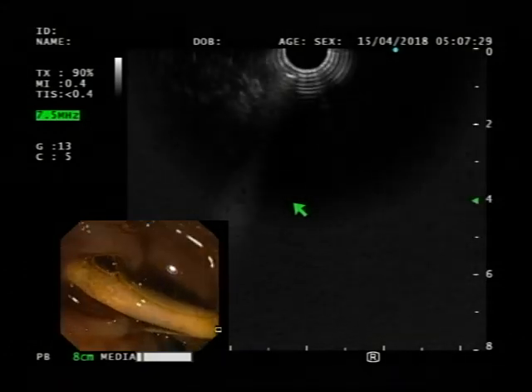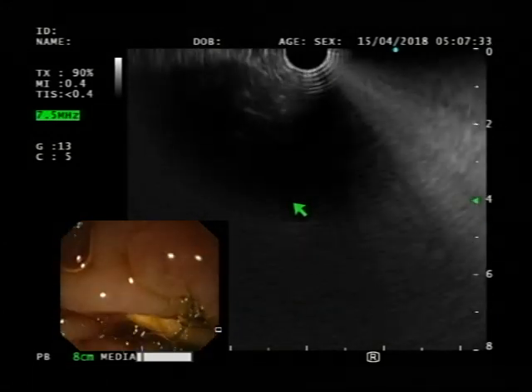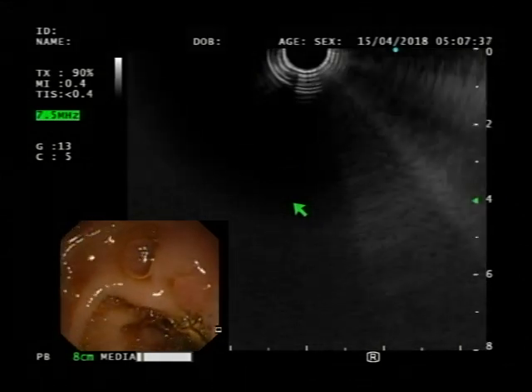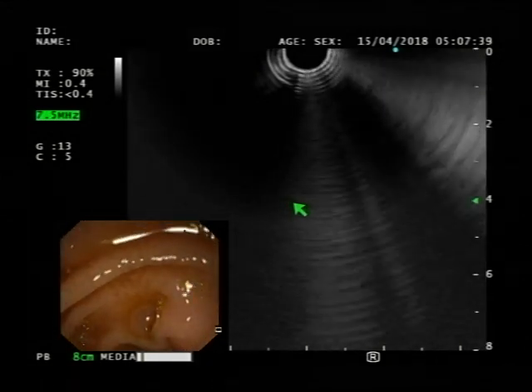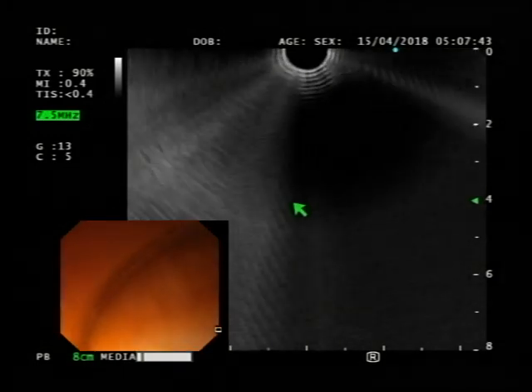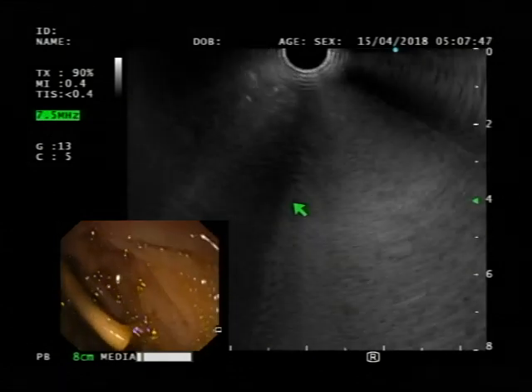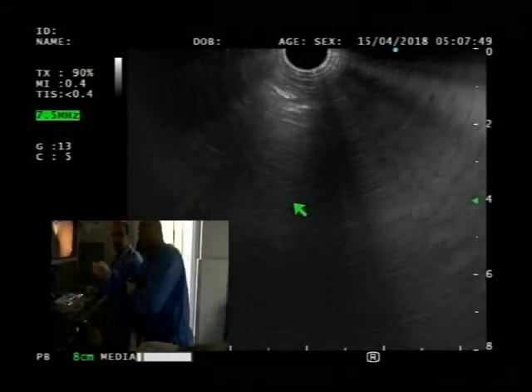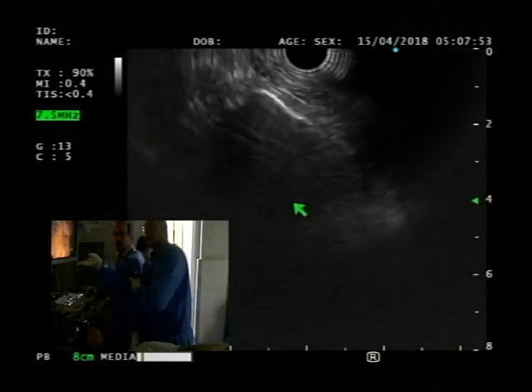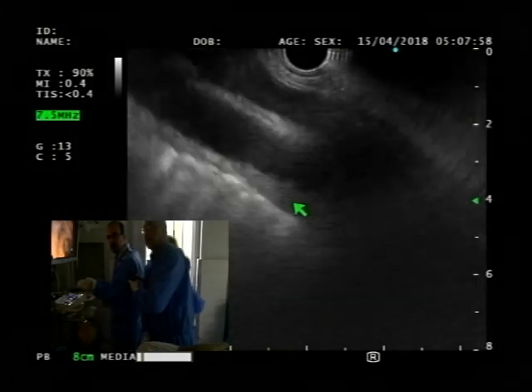Okay. So now that you have that roughly in view, small wheel to the right, excellent. There you go, and thumb down again to get more against the medial wall. And usually this is somewhat unstable in ERCP, so turning to your right stabilizes you. Now this is taking you very far, so you'll have to do thumb down some more to get closer, reduce some more. That's okay, you're still reducing.